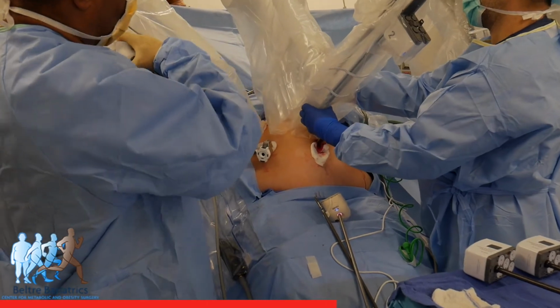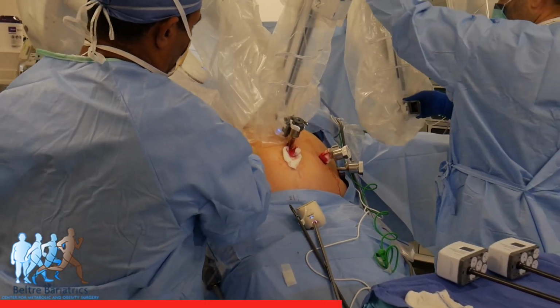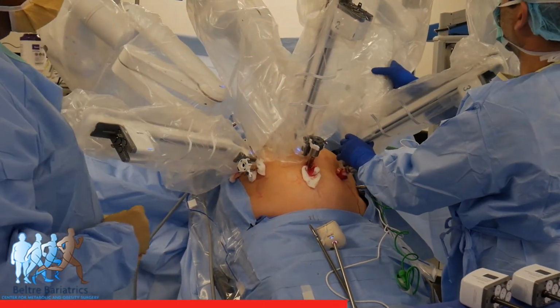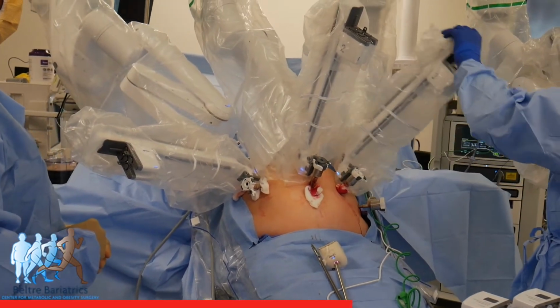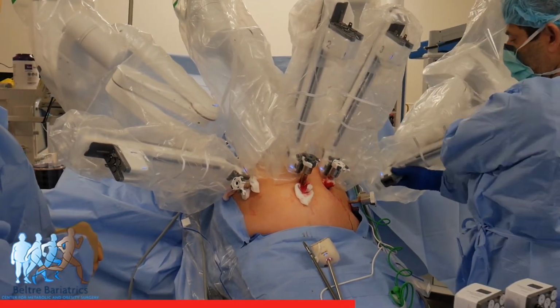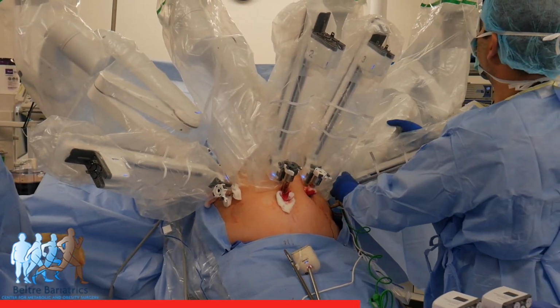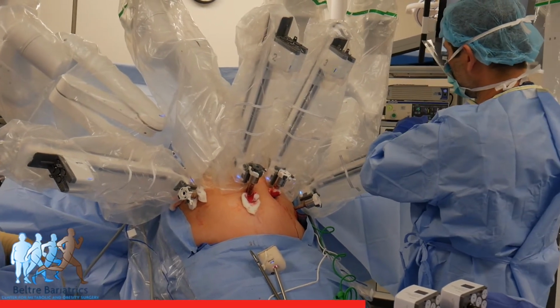You can now observe how we are docking. This is called docking, connecting the robotic arms to the port. Estamos haciendo lo que llaman el docking. Eso es donde estamos ya conectando la mano del robot con los trocares que ya están puestos en el paciente. Esos trocares son como unos tubos que entran al abdomen. El abdomen está inflado, lógico, con dióxido de carbono, con un gas, para que nos dé el espacio para trabajar.